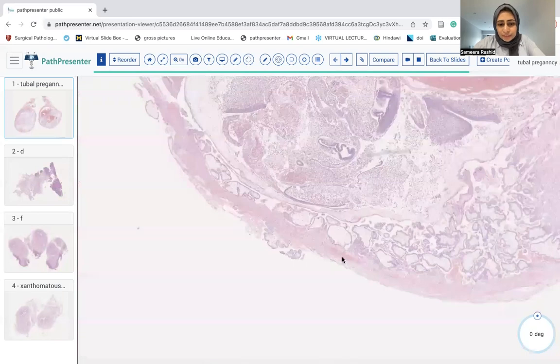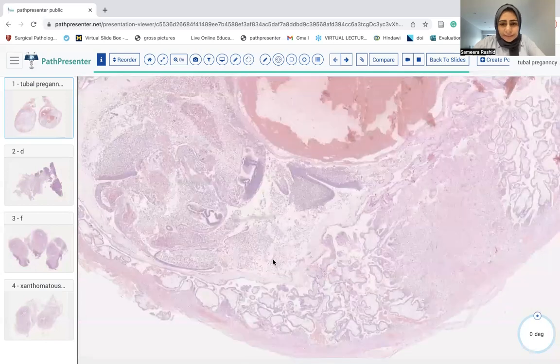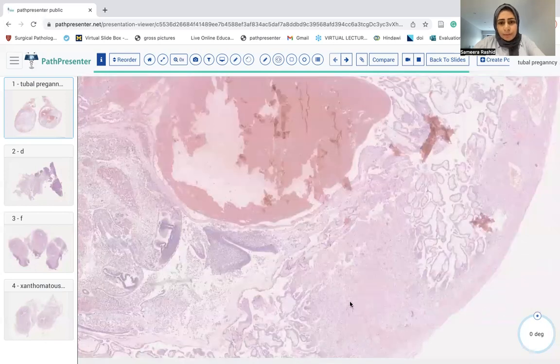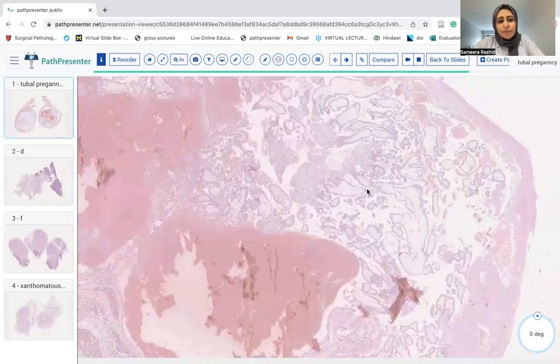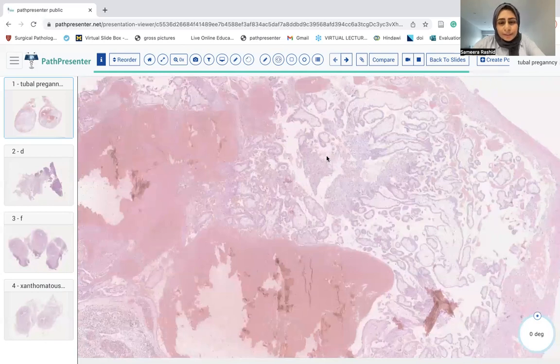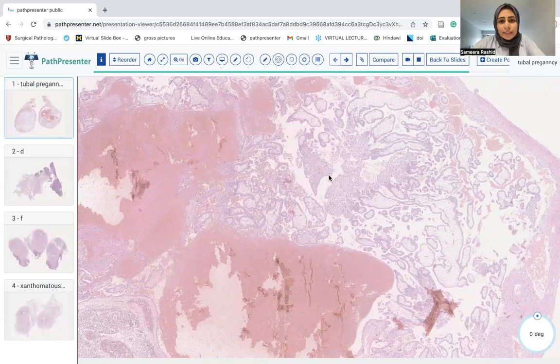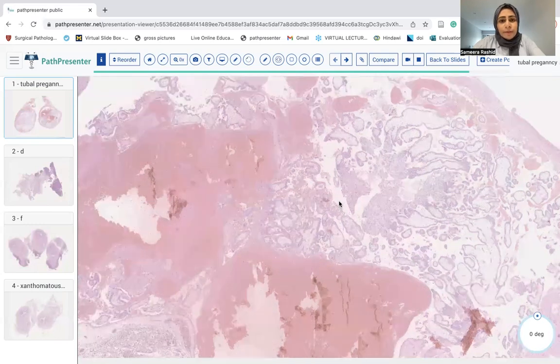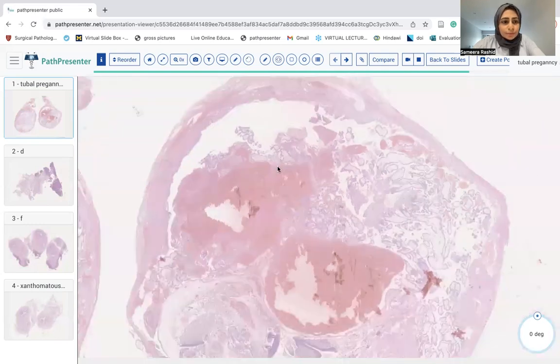So you guessed it right. This is an ectopic pregnancy. We know that the fallopian tube is the most common site of ectopic pregnancy. And these usually present with abdominal pain and rupture.